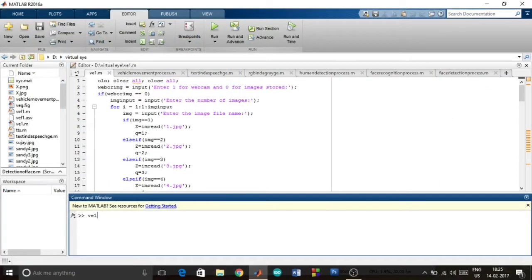On executing our MATLAB code, we get an option either to choose webcam for real-time video processing or prime location identification using GPS coordinates. First, we will demonstrate the identification of location. For example, if the GPS coordinates of the institution where the visually impaired user studies is stored with a code value of 10, the corresponding output as a result of image processing is as shown in the recording.